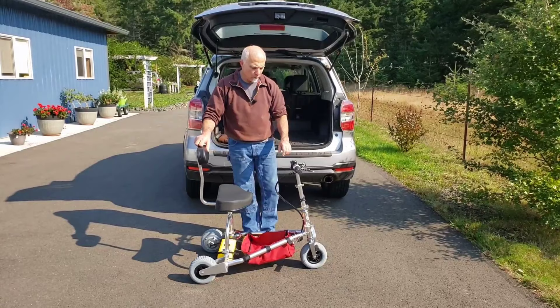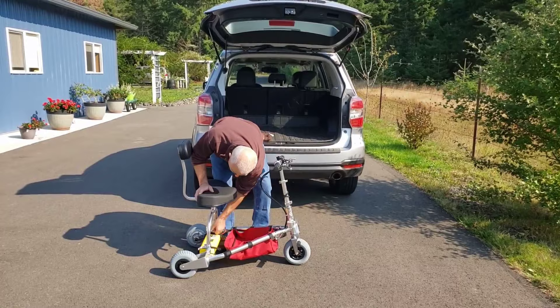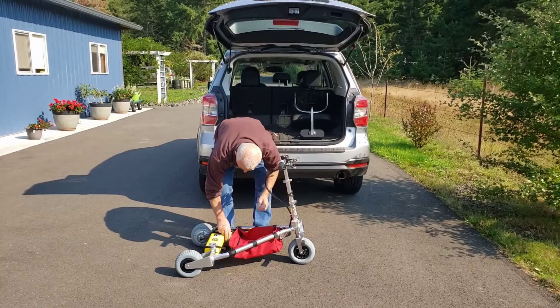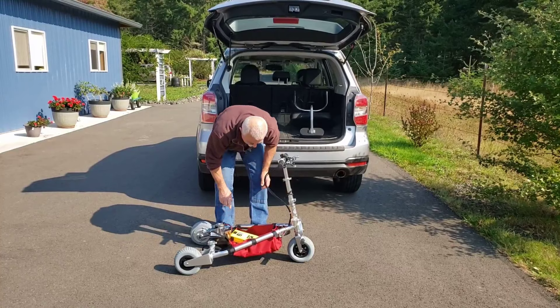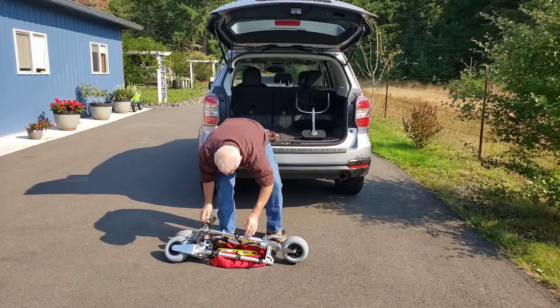The most common and quickest way to break down the scooter and toss it in the trunk of any vehicle: we've got a Subaru Forester here which makes it super easy. Remove the seat assembly, slip the battery out of its tray, lay it in the caddy. It's easy to remove completely and just set aside on its own, but we don't have to. Then fold the frame by means of these two locking pins, fold it down, and set it in.